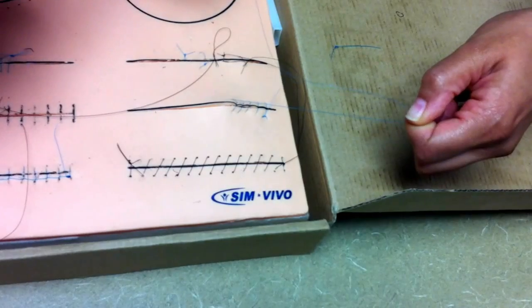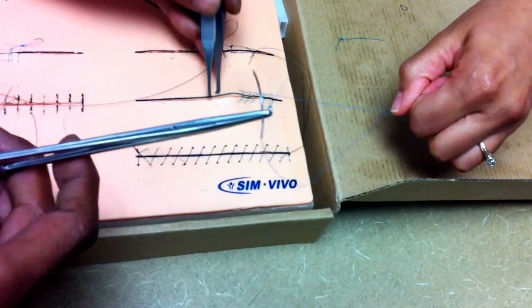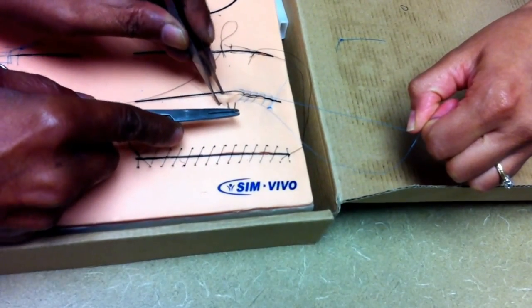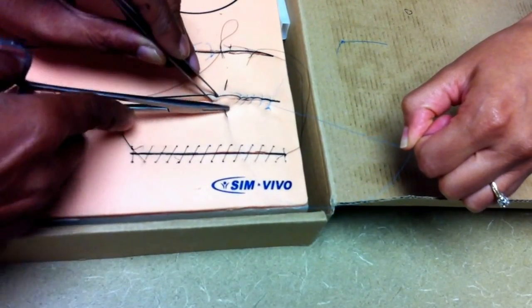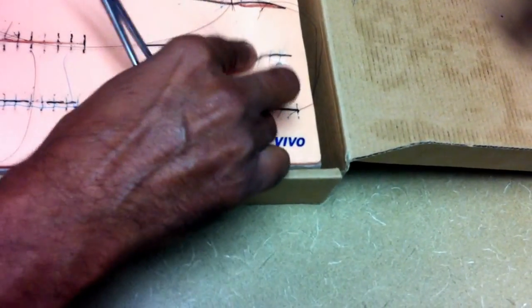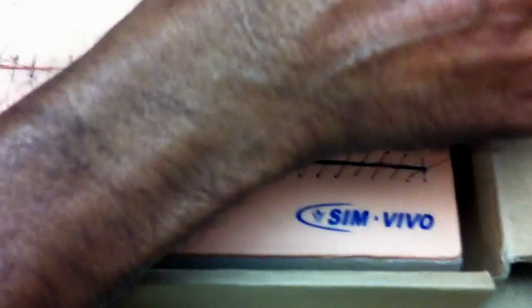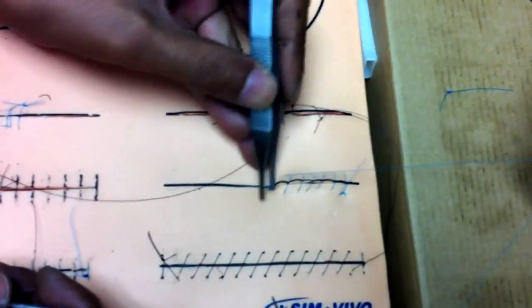So I'm going to stop here. I'm going to close it off so that you've all seen the procedure. So this is the technique for continuous non-locking suturing. If you've done a good job, it should look more or less aesthetically nice also. It should look more or less parallel to each other, and this is going to be my last. And I'm going to show you how to finish it off. Suppose the suture line was only this long, how to close it off. I'll show you just now.